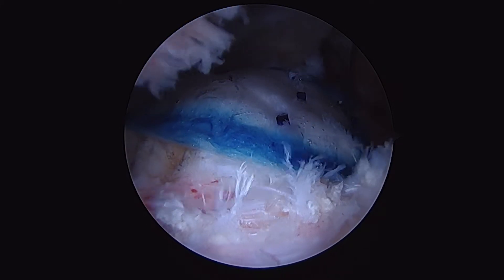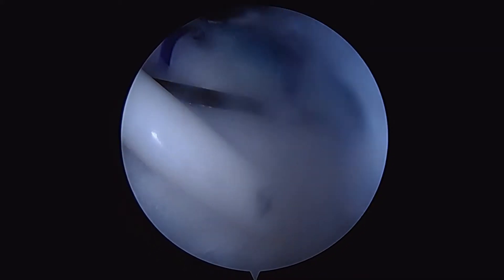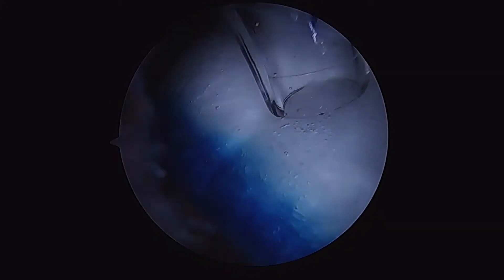So we have to take an approach utilizing our previous portal by first rotating our arm, and then secondarily, we're going to fixate the edge of our graft distally and then rotate our hand to slide the implant down a little bit further along the lateral edge of the rotator cuff. As we insert our staples, we're going to use our staple inserter to push the graft further down into the position that we're trying to place the graft in.